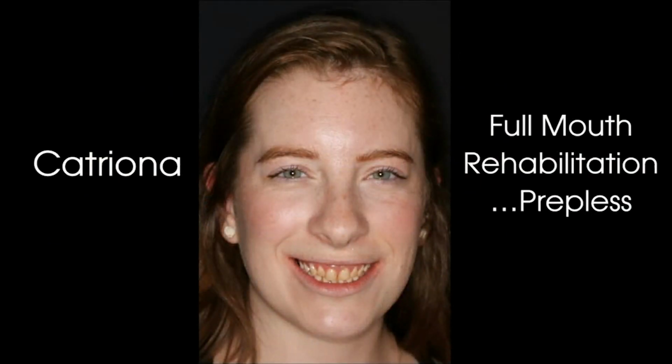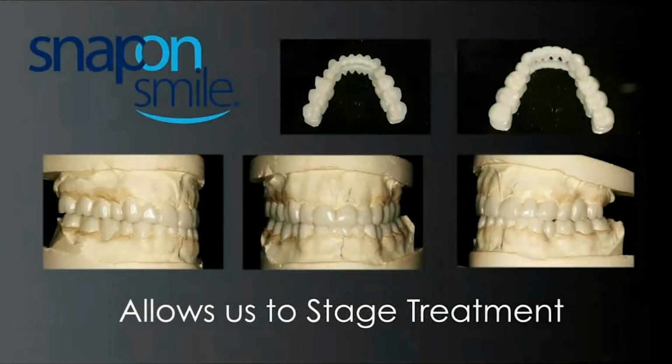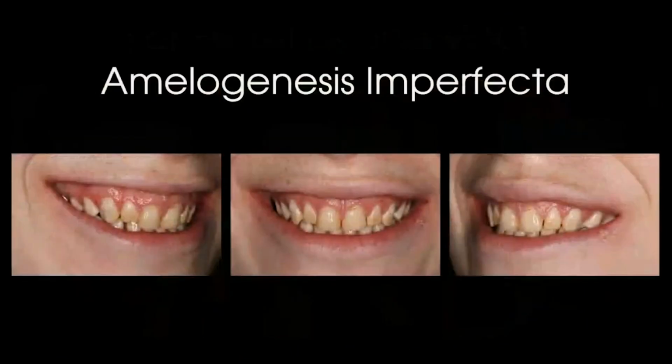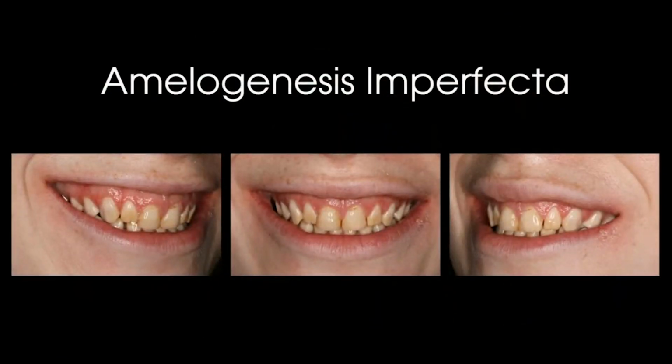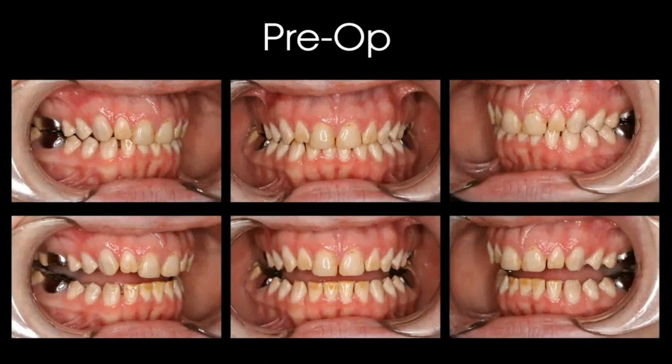So that's one case. Another case is a full mouth rehab, not prepping the teeth at all. So here goes some planning with this one as well. She comes in to see me, and she's wearing a snap-on smile or acrylic on the upper and lower arch, because deep down inside, this allows her to control the vertical dimension. But she was wearing this for a reason, and that is she has amelogenesis imperfecta, where she's got mottled enamel. It's discolored. You can see where it didn't develop perfectly, and a lot of bonding's been done on it. And that's her pre-op shot.